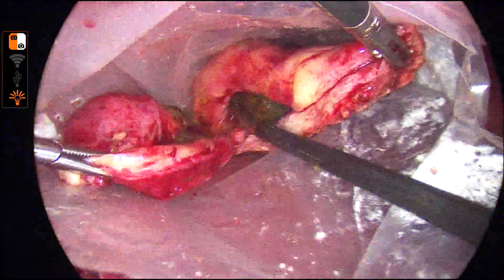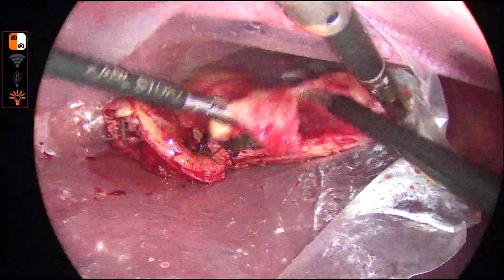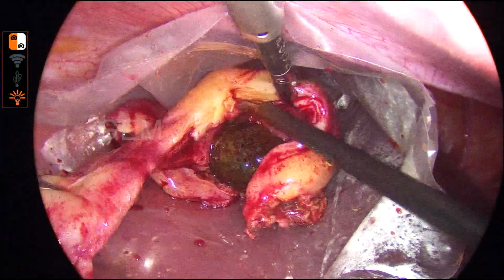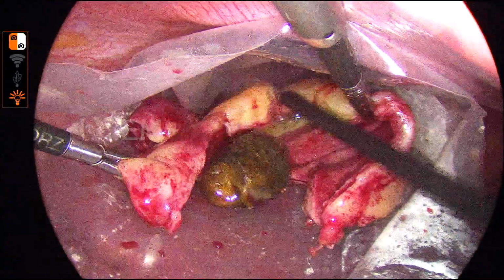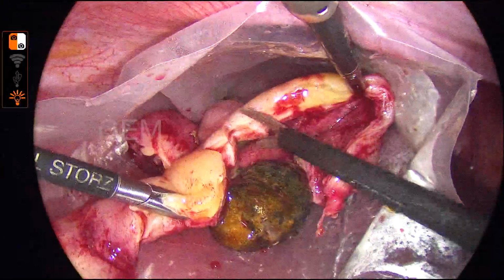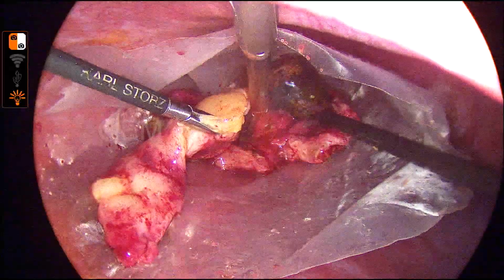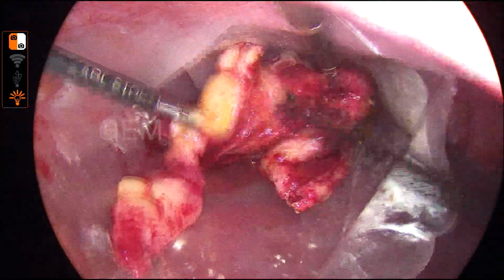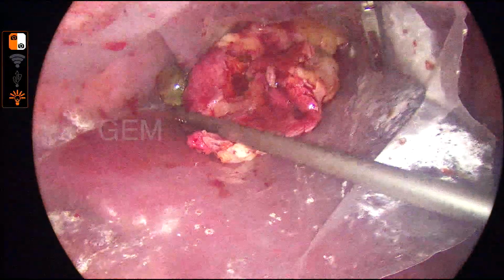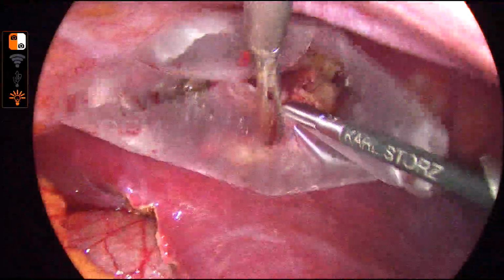And I am dividing the gallbladder piecemeal. Usually I cut the full length of the gallbladder into 3 to 4 pieces, then I can take it through the 10 millimeter epigastric port. You can see the very large stone and also multiple small stones, and it is within the endobag. I am dividing the gallbladder, and on and off I clear all the infected fluid so that it is clean and there is no contamination.